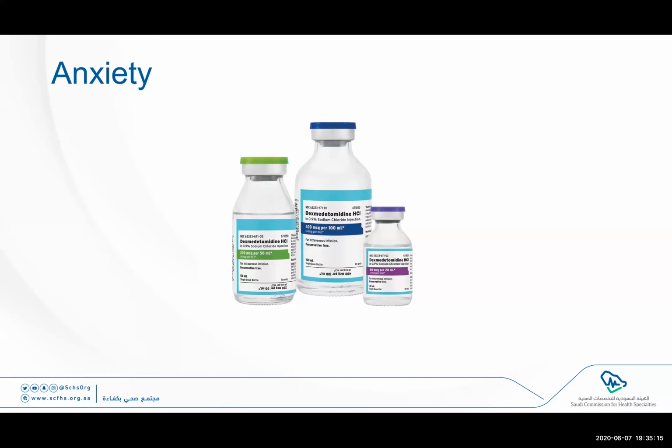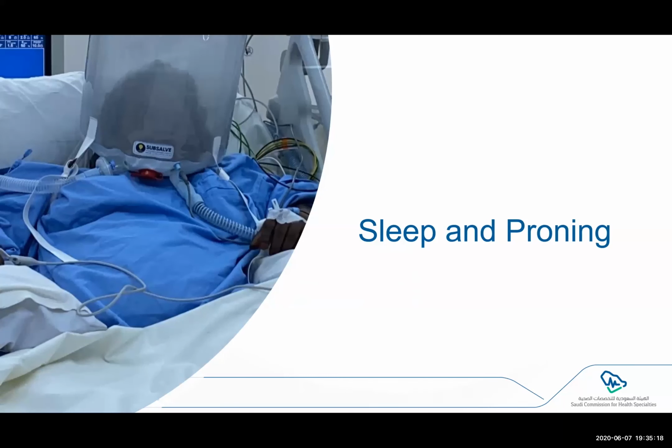In terms of sleeping and proning, because this helmet does not have a rigid collar or a rigid base, a lot of our patients are able to sleep. This is actually one of our patients in the unit, and she's sleeping with the helmet on. And also because we are performing a lot of awake proning or self-proning, proning can be performed with this helmet on. There is not yet evidence about proning in helmet ventilation, but there are ongoing studies and some published data about the feasibility of performing this.